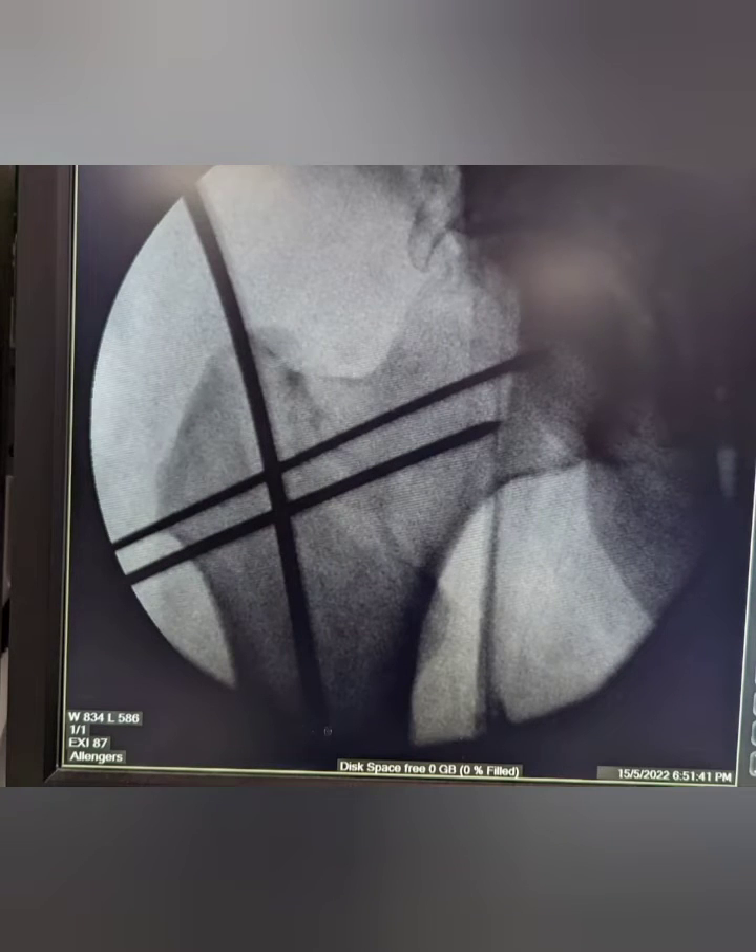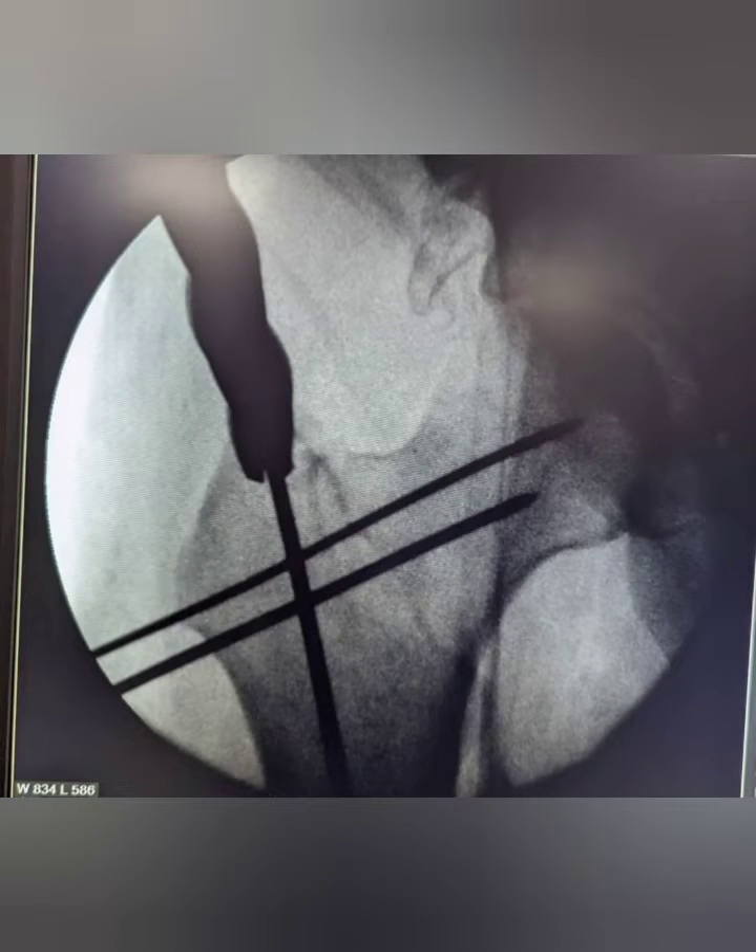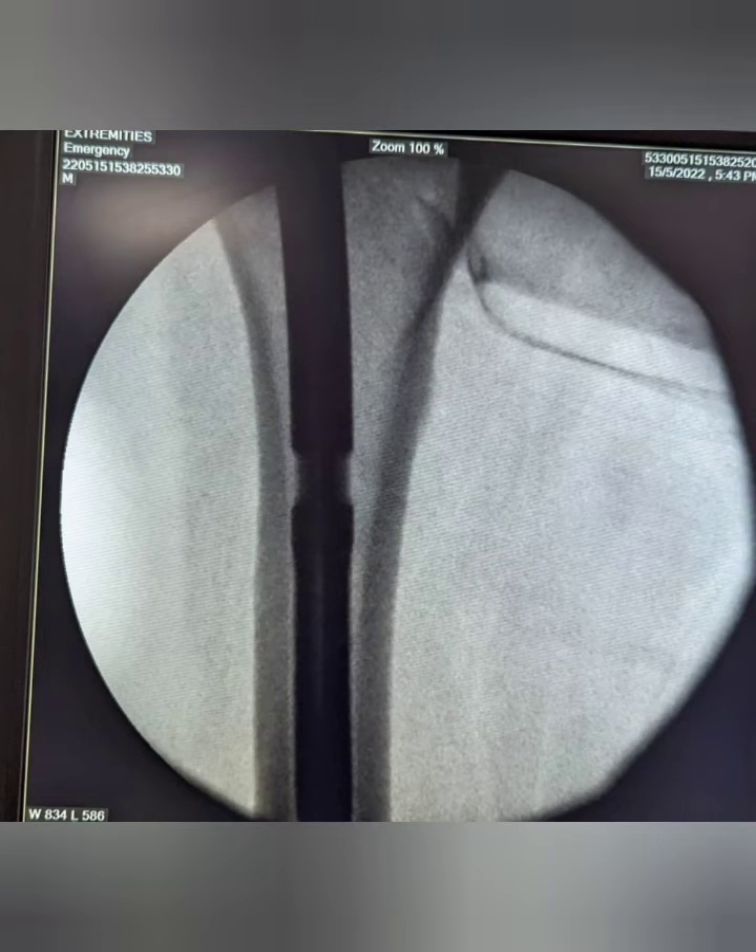Then we pass a guide wire through the entry point to the fracture and distal side, and we ream over that entry point. Reaming is done according to the diameter of the canal, and then the nail is passed with the jig.